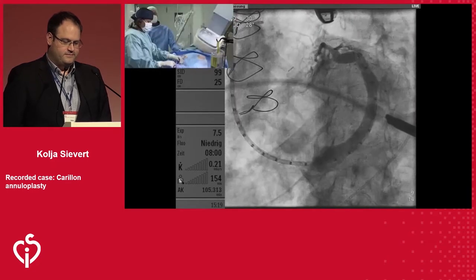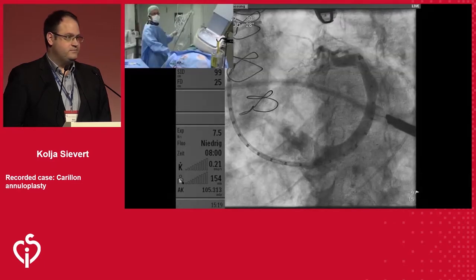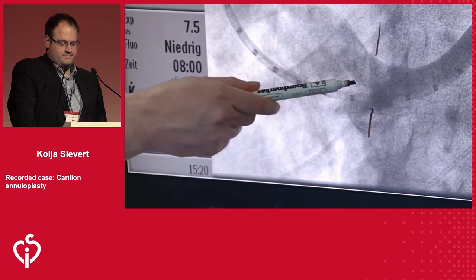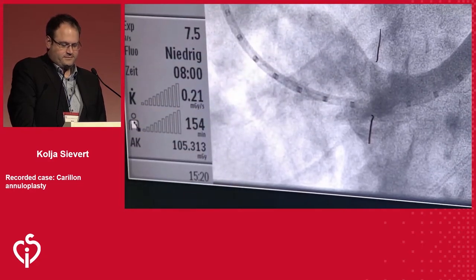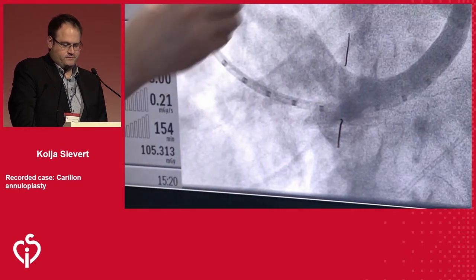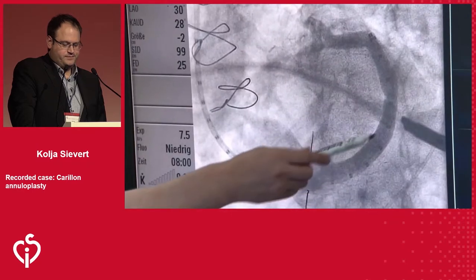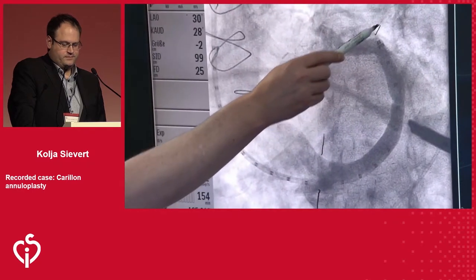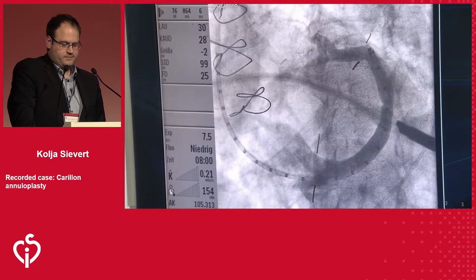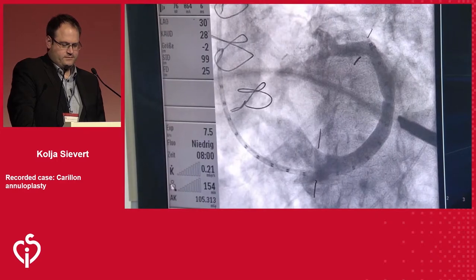Well, it's not that long, you see. Well, Evan, can you count that? So we've said the coronary sinus ostium is roughly in this zone here. I've drawn some marks on the screen to indicate that. And if we count the marks on the marker catheter here, this is actually just about 9 centimeters right there. So we may want to come a little bit further. 9 is enough. It's enough for placement, but we could consider going back to the more advanced position.